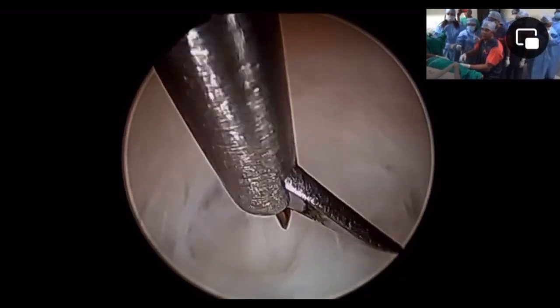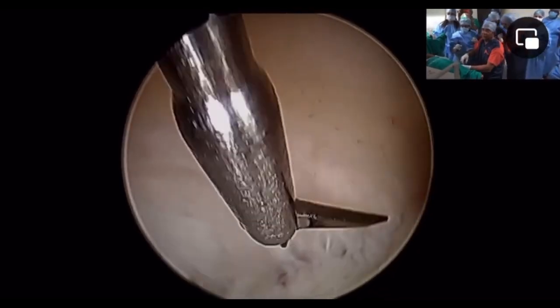Okay, so keep watching until we see the myoma. It will be seen behind a curtain of the capsule, and then follow how to use the scissor to cut, to elevate, to dissect, and to enucleate.